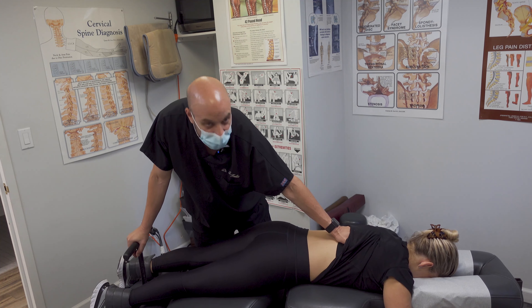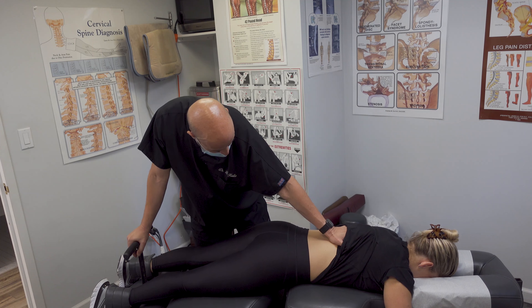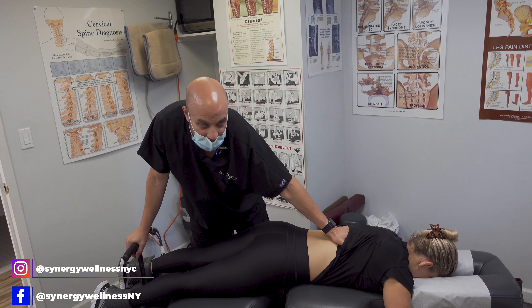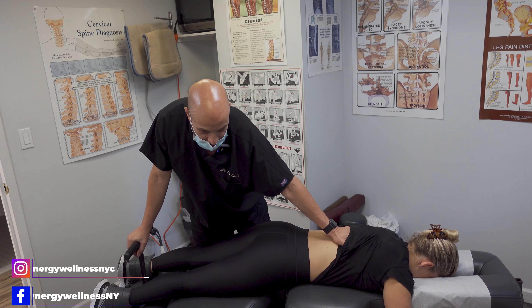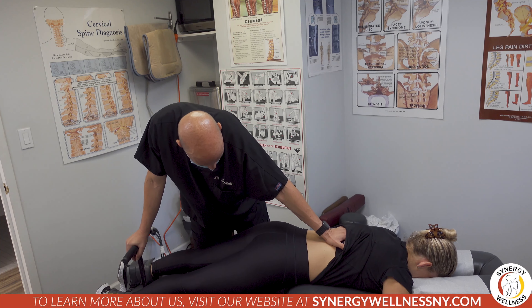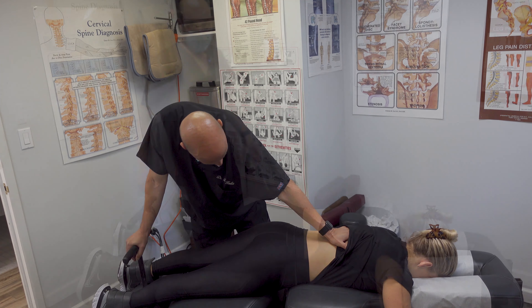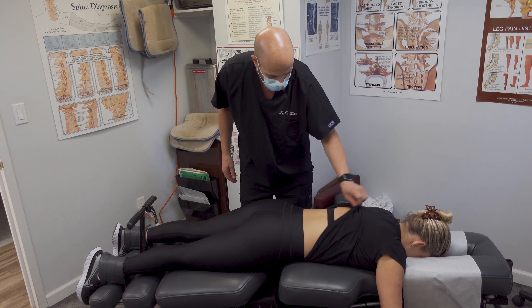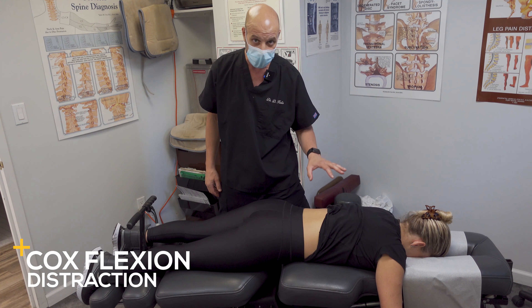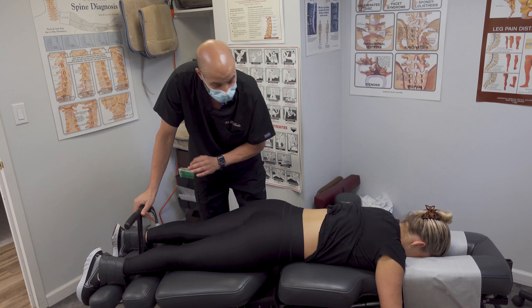You'll see I'm placing a semi-light hand on the spine and decompressing everything below this level — opening up the facet joints, opening up the space where the nerve exits, and taking pressure off the disc. It's similar to traction or decompression but better, because it goes specifically to the joints that need to be decompressed. It puts the spine in flexion, taking pressure off not only the discs but the spinal cord and the nerves.